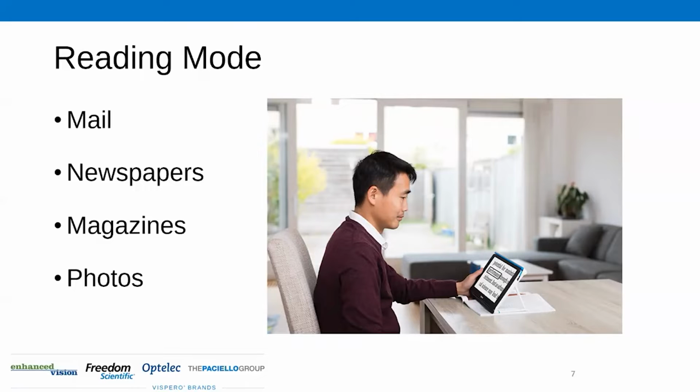It's ergonomic for you, so you don't have to lean over and arch your back when you're reading something. So this is great to be used for reading mail, newspapers, magazines, or looking at photos. We just got through the holidays. I'm sure a lot of you got some different cards that you wanted to read, or pictures of your grandkids or your kids. And you can do so in the reading mode.